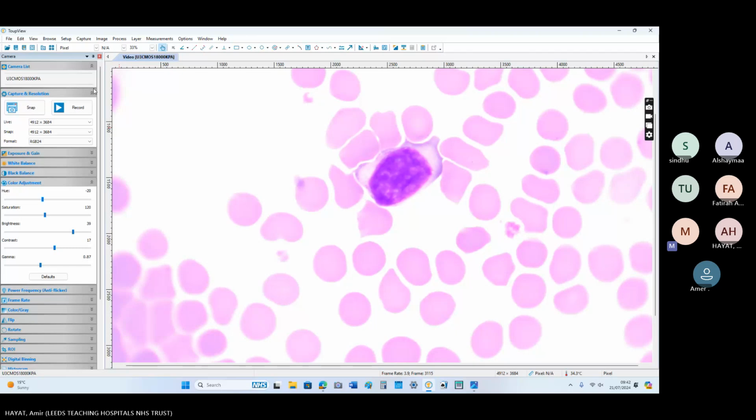The first thing which comes to my mind was infectious mononucleosis, keeping in view the patient's young age, the presence of fever and lymphadenopathy. I don't know the status of the spleen, because the chromatin of these atypical cells seems to be mature. It's not immature like we have in blasts. And they have abundant cytoplasm which is scalloping around the RBC. So infectious mononucleosis came to my mind.